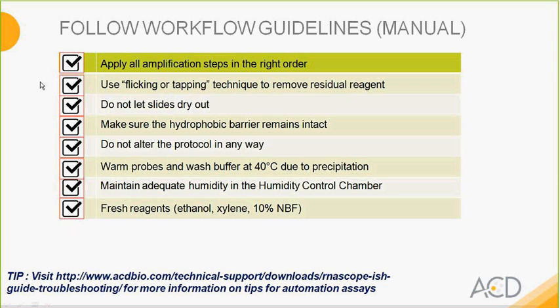We will now review some of the guidelines for the manual assay. This information is available in our troubleshooting guide that's now available on our website when you choose the support tab. Here are some things that we think could be useful for you, including making sure that the residual reagent is removed when you're washing and after washing and when you're adding the reagents. Do not let the slides dry out, and we encourage you not to alter the protocol in any way. We have optimized the protocol for your use for all your samples and assays.